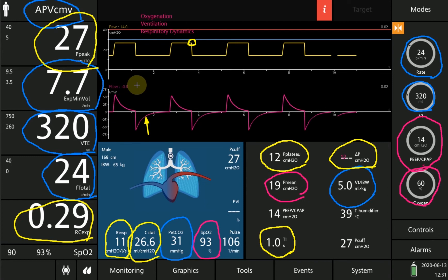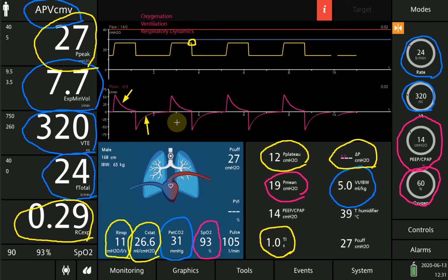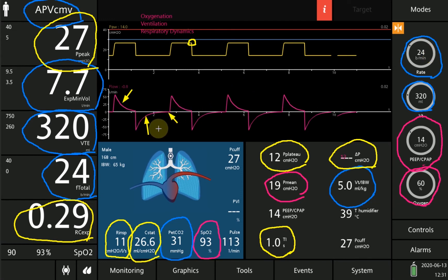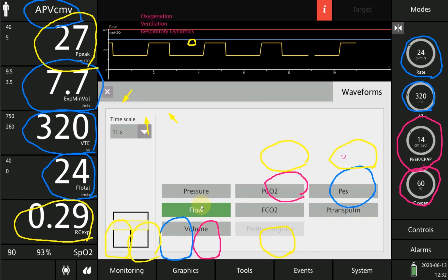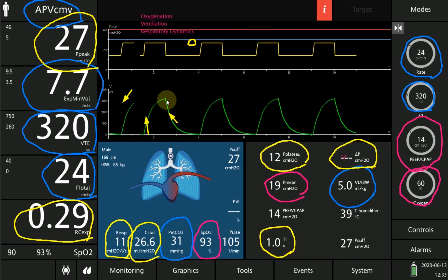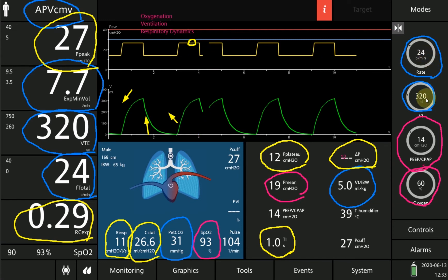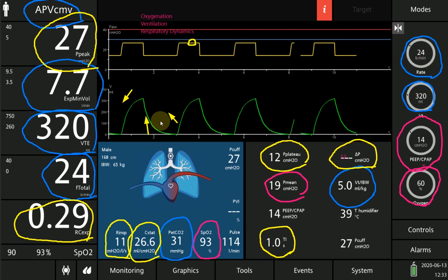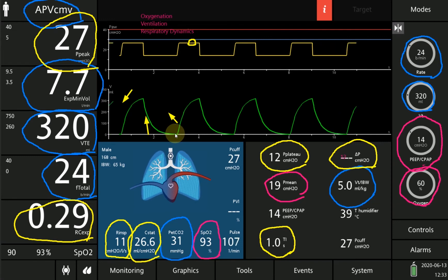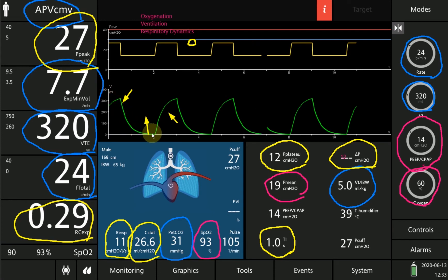The inspiratory flow shape is a decelerating wave and the expiratory flow returns all the way back to zero before the next breath, meaning there is no dynamic hyperinflation with this ventilation. You can also determine that the rate could be increased slightly without major influence on expiratory flow. On the volume-over-time curve, volume rises to the targeted tidal volume of 320 ml on inspiration and returns to zero on expiration with no air leak — the lung is completely emptied.